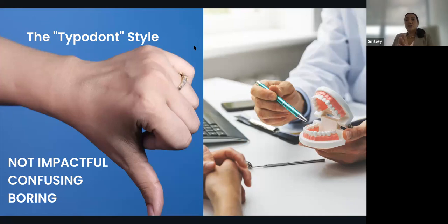I want to show you different ways that I've seen doctors use throughout the times. And I want to bring something very different for you. I know that the way we are consuming today has changed, especially after the pandemic. A lot of people are clicking. We don't have time to wait a lot, right? Amazon, different ways to consume products. And this is the same way that we are bringing information for our doctors.